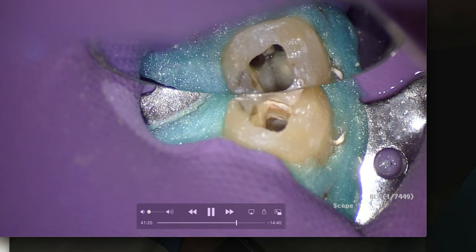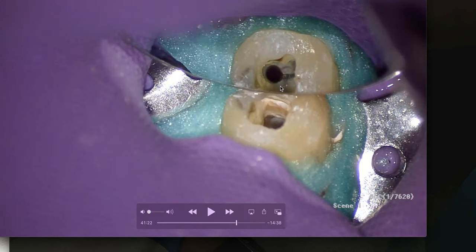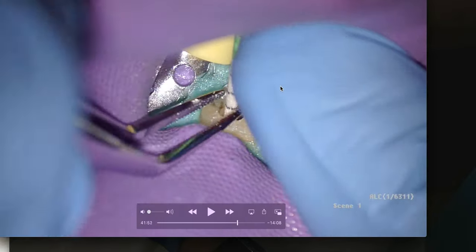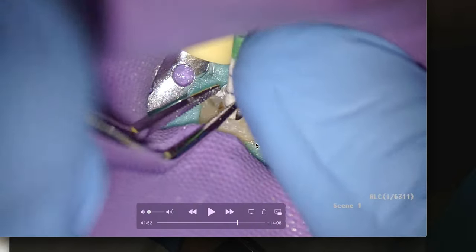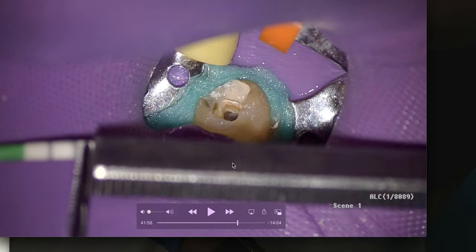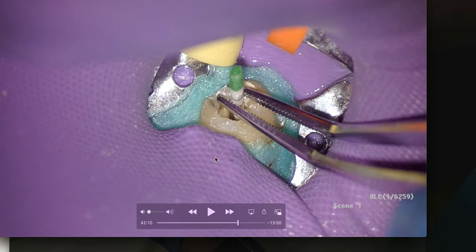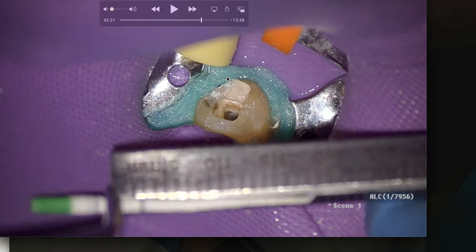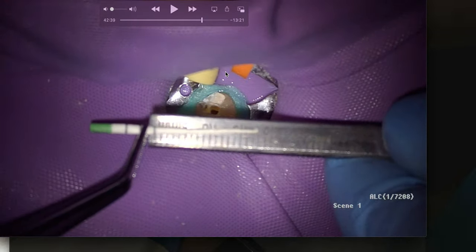Now we're drying our canals — one huge distal canal and two mesial canals. There's no white line or white dot indicating a middle mesial canal; the probability is low, but we checked. To dry, I'm bending the paper point and placing it into the canal to working length — it bends the paper at the end, and that validates in my own mind that my working length is correct. Doing that for each canal. We're at 18 millimeters.